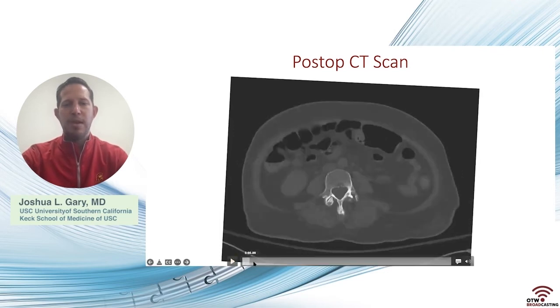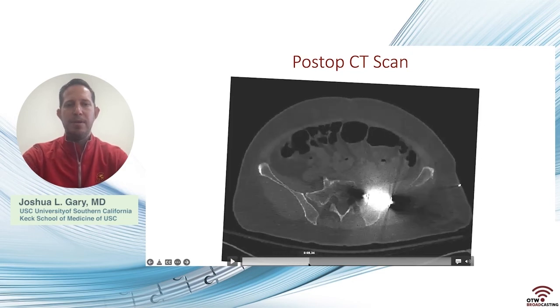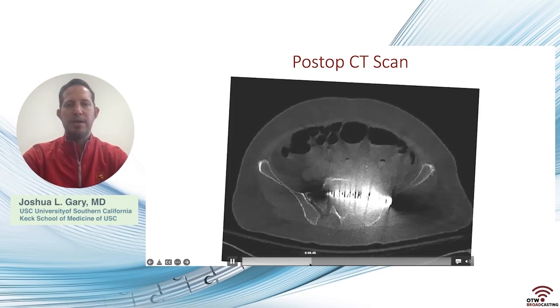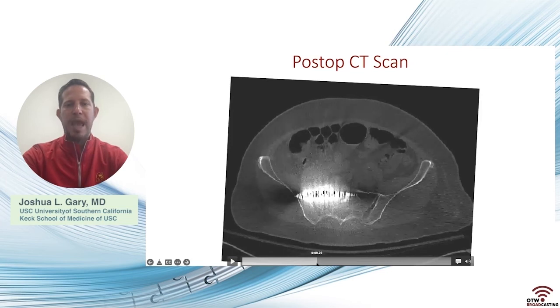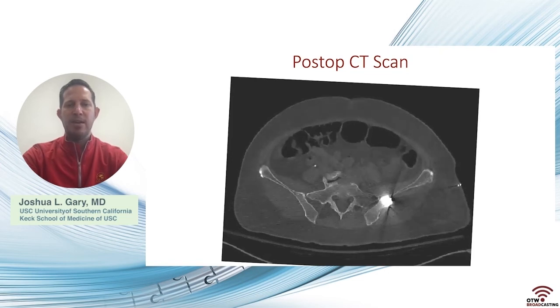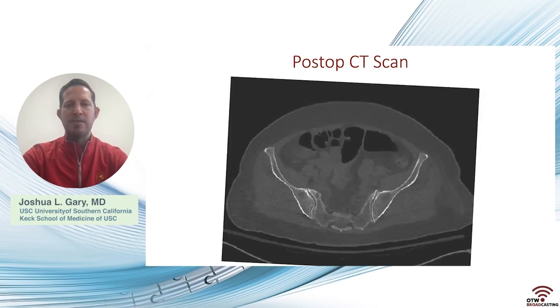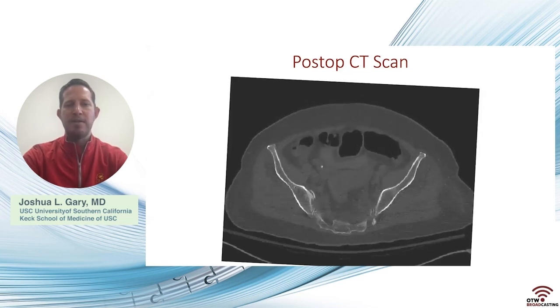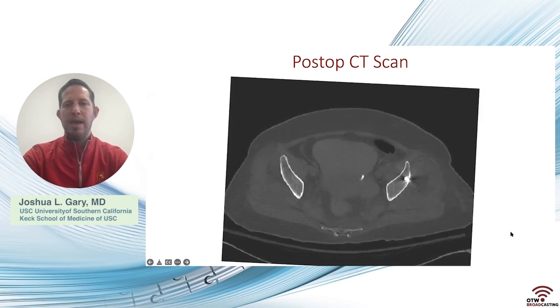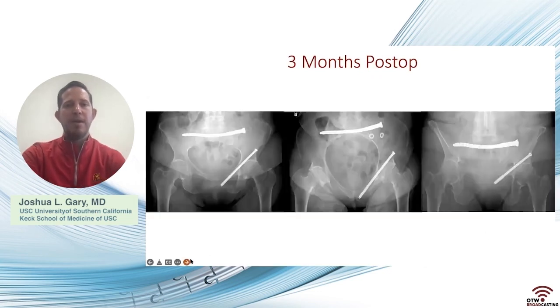And you can see just coming through it again. There's the rod screw starting. We're able to be anterior to each of the foramina. It's a little hard to see with the scatter, but then transsacral, transiliac, and also safe for L4 and L5 behind the anterior aspect of the lateral sacrum on both sides. So really a nice solution for this problem that we didn't have. And she did very well clinically.